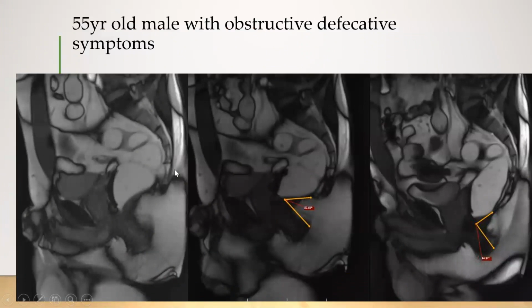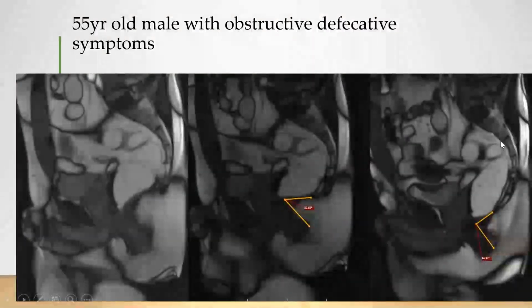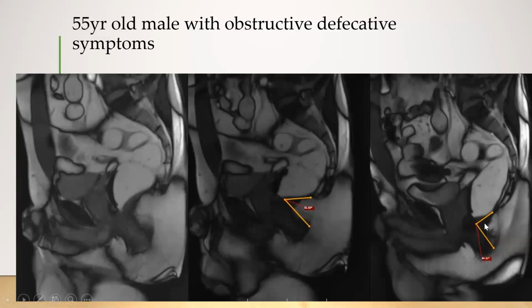Yeah, so just continuing with what I was already talking about, it was a 55-year-old male who again had symptoms of obstructive defecation. So trying to again emphasize to you simply that at rest, you see an obtuse angle of the anorectal junction, which becomes more acute. And as we can see here, even on the patient having the strain phase, you realize that the lumen becomes further and further narrowed out because the angle is becoming more and more narrowed in this particular situation. So this patient also has symptoms of an obstructive defecation.